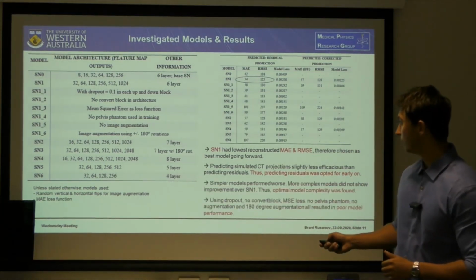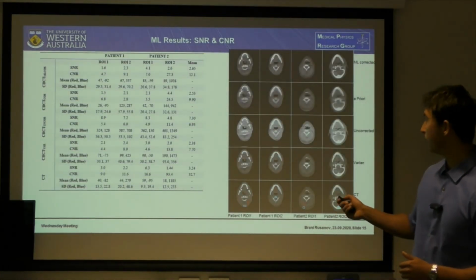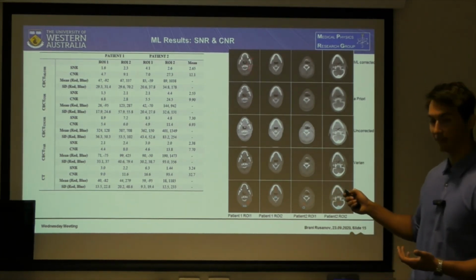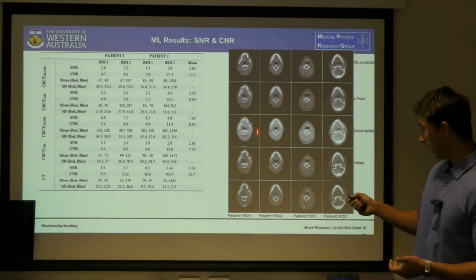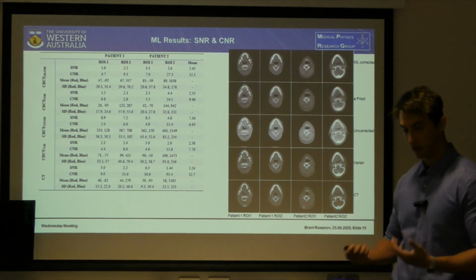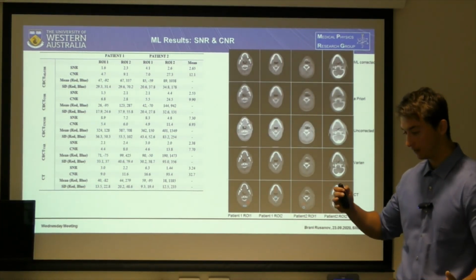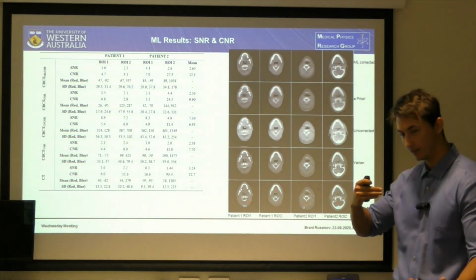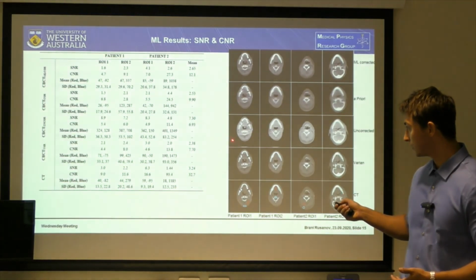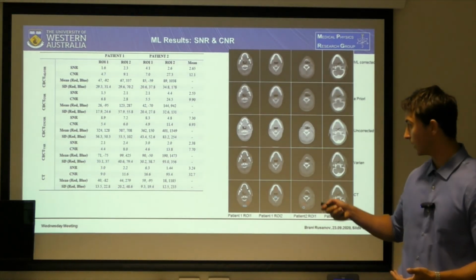And in general, there's just a lot of air region around the head, so it's hard to see really if there are any artifacts there. There is a truncation artifact around the edge, because I used RTK to reconstruct, so it's not a very sophisticated reconstruction. Photons may be attenuated and measured by the detector, but if those attenuations occur outside of the reconstructed field of view, the algorithm doesn't know where to put them, so it accumulates around the edge.